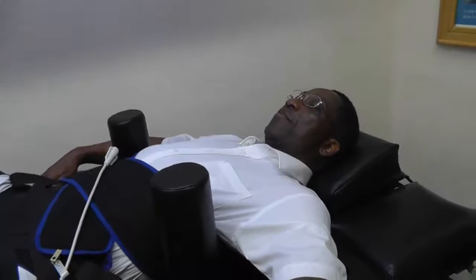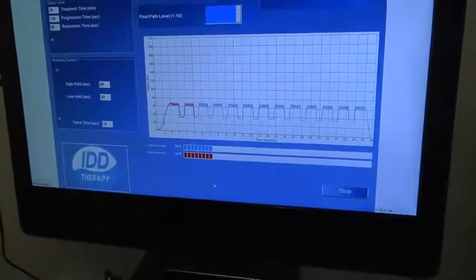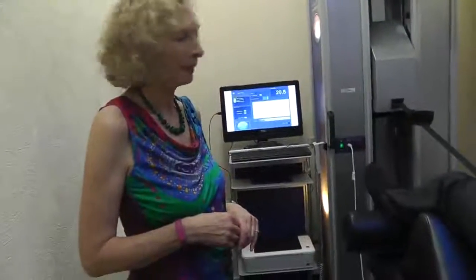We're just coming up to the end of the second high tension with John, and when it reaches this point, this is when I open the bottom half of the table — I'm just going to do that now. So the next time the tension comes on you'll feel a much bigger pull and a much bigger stretch in your back. The idea is that in the first two pulls your body weight is acting on the bed creating friction, and when you release the bottom half there's no friction.